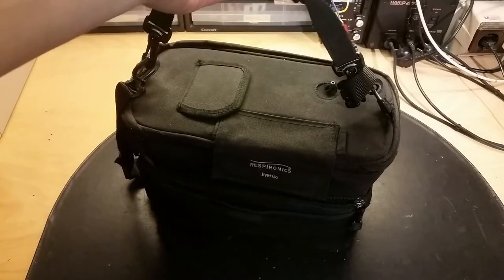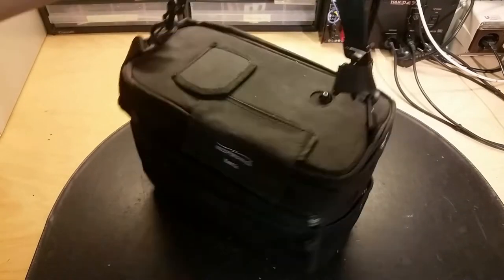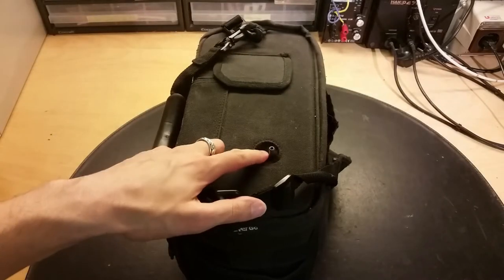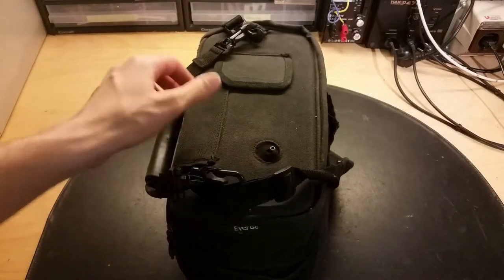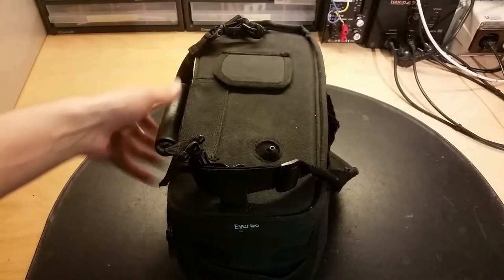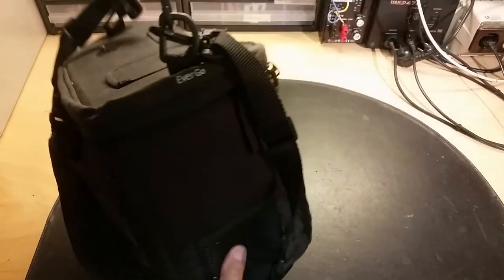It reaches a certain amount of time that this unit has been turned on - for this one I think it's around 1000 hours. You should connect the oxygen mask here, and in here we've got the display and a charging port over here.